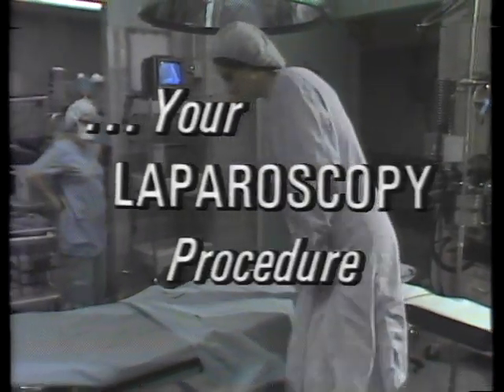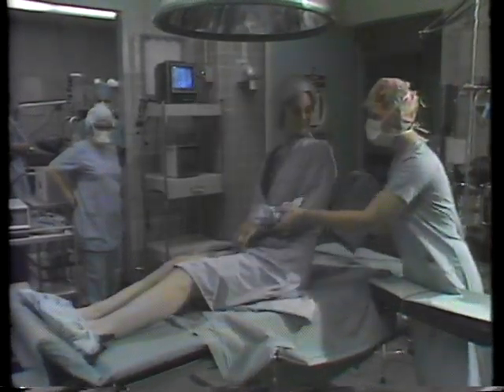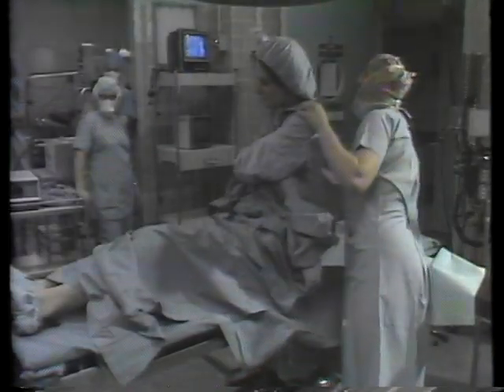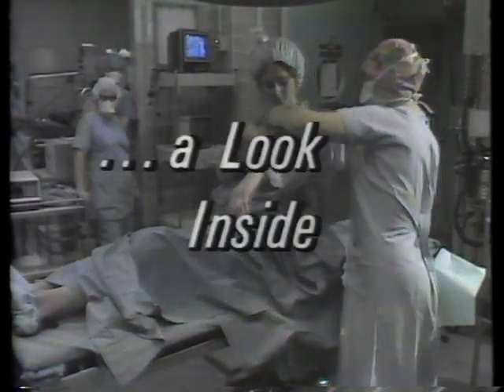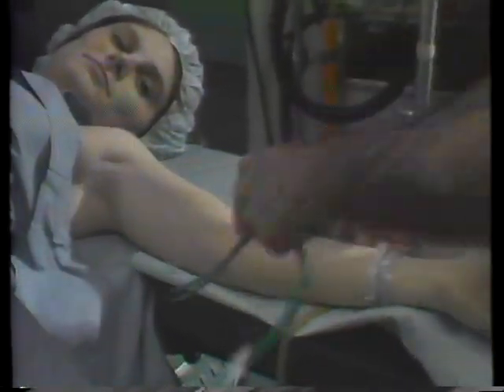Using a laparoscopy procedure, your physician will be able to view your internal organs and even operate by using an optical device inserted through a small incision in your abdomen. We will now see a laparoscopy examination similar to what you will have.